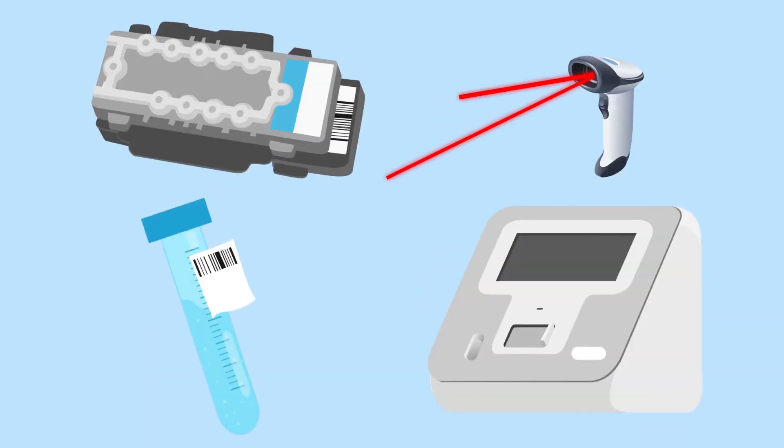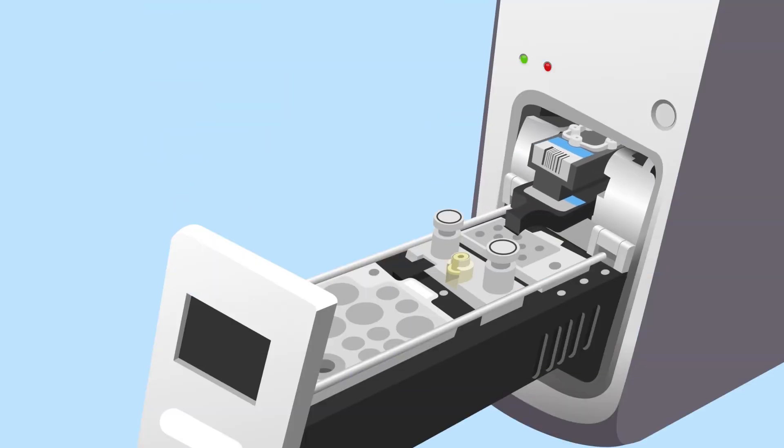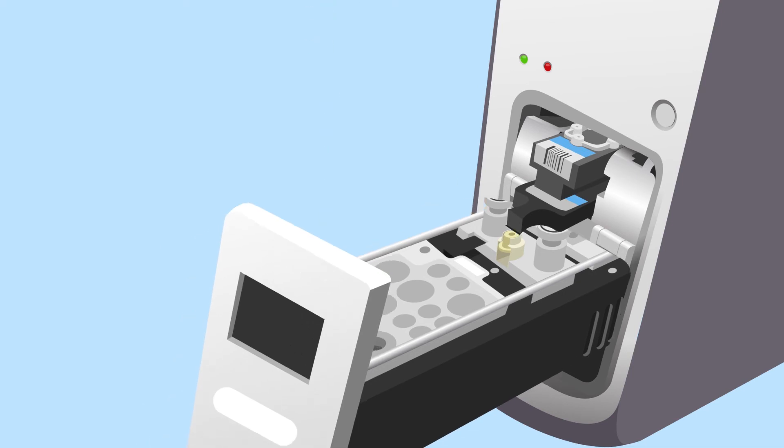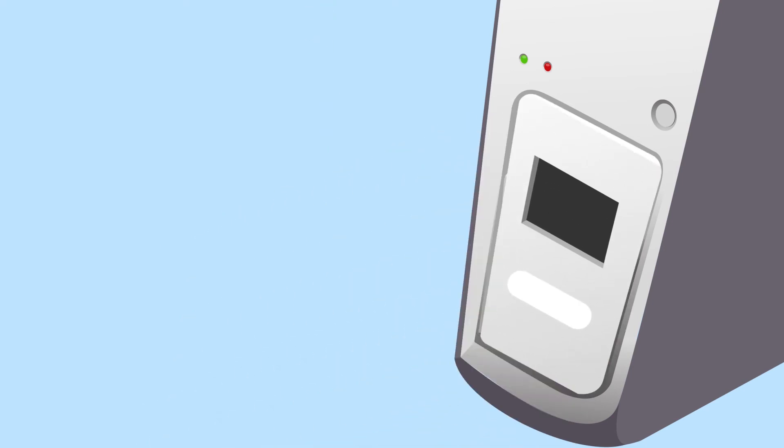Then use the Verigene Reader and barcode scanner to match a test cartridge with a sample ID. Finally, load the test cartridge and sample, then close the drawer to begin automated test processing, which takes about two hours.